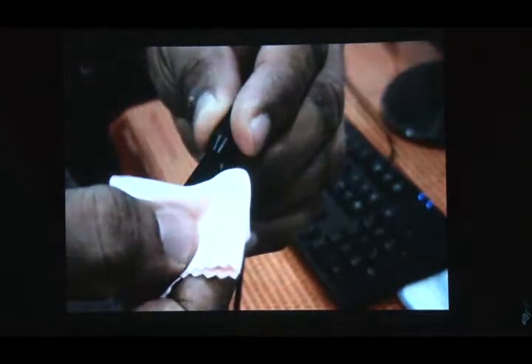After that, you have to clean with saline, because they will get deposits on the surface which can be transferred to the patient. After cleaning with the chemicals, it is better to clean with saline also. Whichever is going to come in contact with the patient, like applanation, B scan, A scan probes and all, contact lens solution is a very good option. Instead of alcohol, straight away use your contact lens solution, take it in a small gauze, wipe it, clean. It's not going to harm your cornea after that.